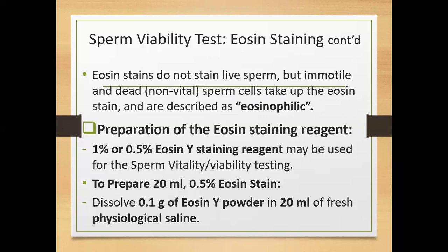And that is going to create an abnormality if you are doing your abnormality check. And when you are using water for your sperm count dilution, the cells have to be immobilized. Put the specimen between 50 to 60 degrees to immobilize them.